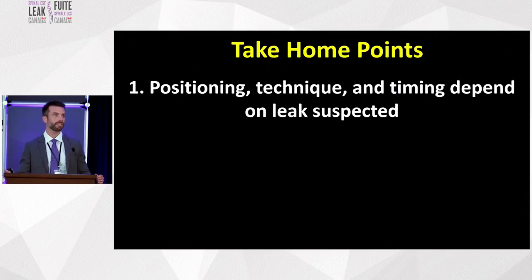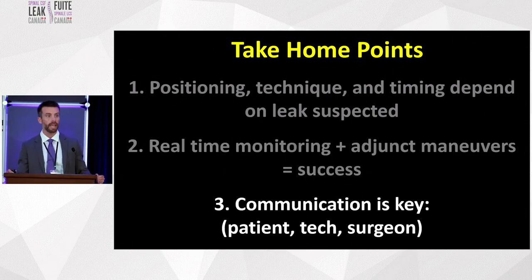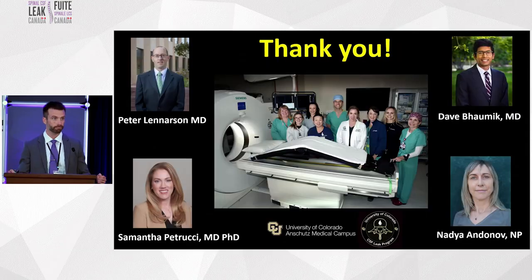So, take-home points. Positioning, technique, and timing all depend on the type of leak you suspect. A lot of the work is going into this before the actual exam itself. You have to be real-time monitoring with all of these because these adjunct maneuvers, little tweaks, can help you find your leak. And then communication is absolutely key with you and your patient, with you and your technologist, and also, of course, with your surgeon. Thank you.